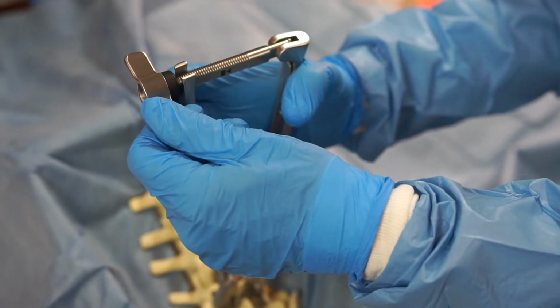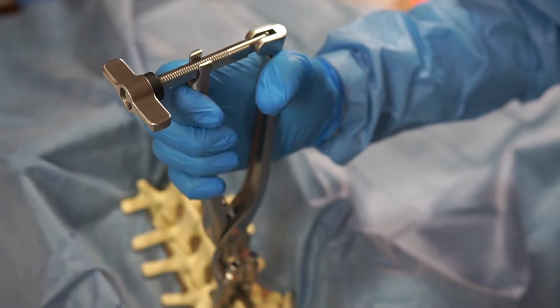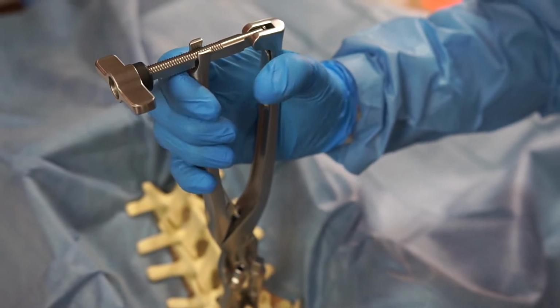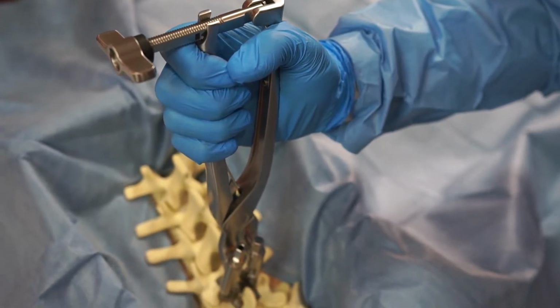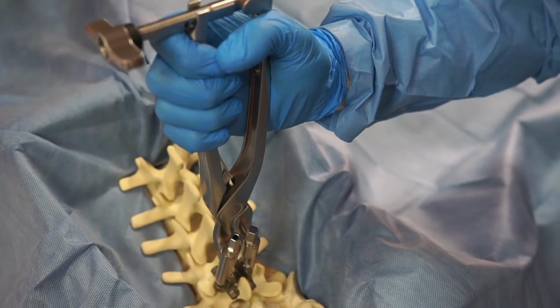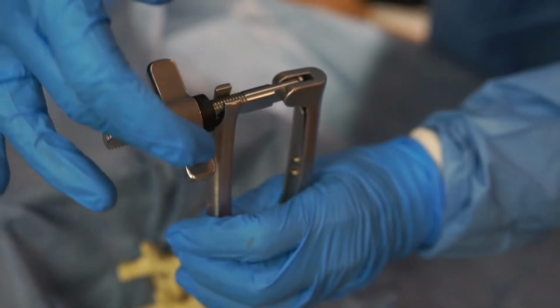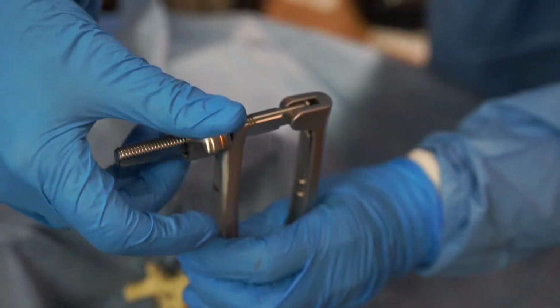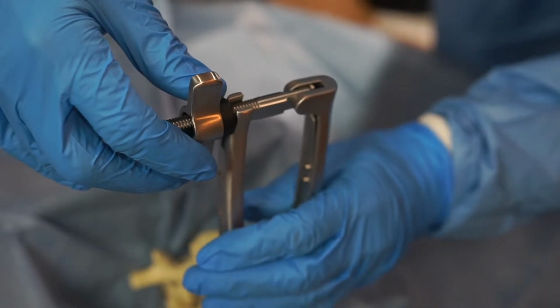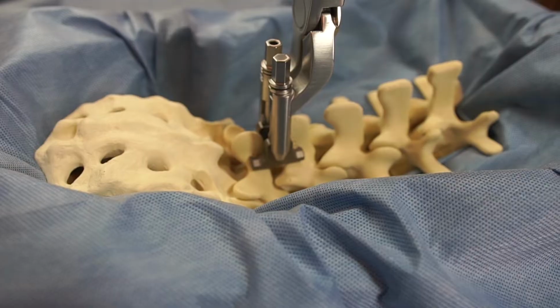Carefully lift the ratchet in order to begin compressing the arms of the PG inserter compressor. Carefully increase the pressure to ensure that the implant spikes are properly seated into the spinous processes or lamina. The knob on the threaded ratchet arm can be turned clockwise to increase compression. Do not overcompress the implant. Excessive compression may lead to fractures of the spinous processes.